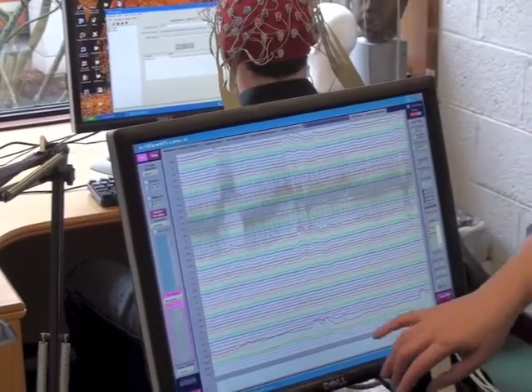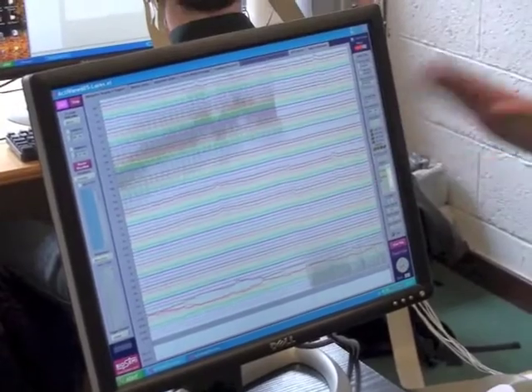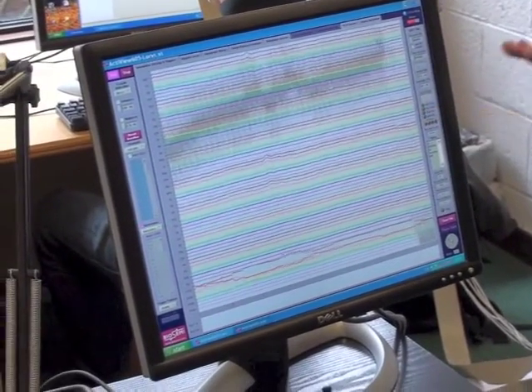Okay. Now, if you look at these lines here, it's hard for you to know because you've never looked at it in any other way. But they look fine. The only one that's looking really dirty is this one going up and down the screen that I'm going to fix in a second. At the moment we are having electrical interference, and you can tell that from this data. But I can tell that the electrical interference is completely cleanable. This data looks absolutely fine.